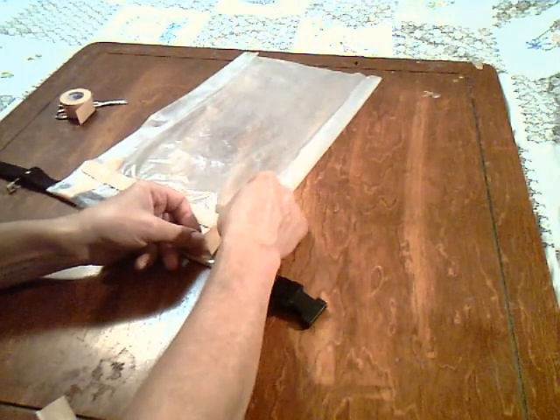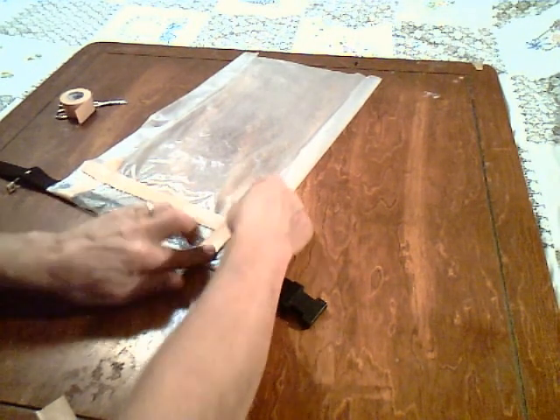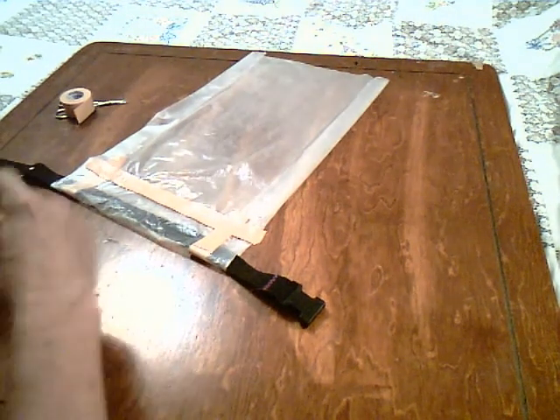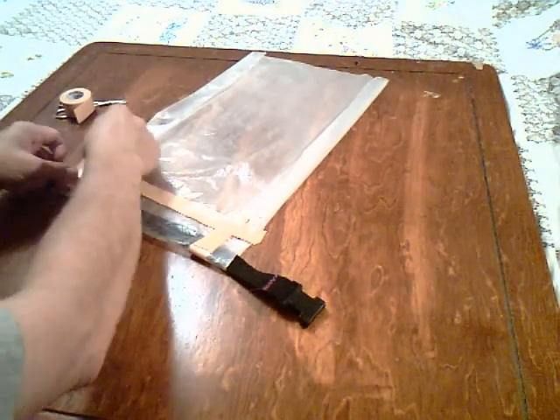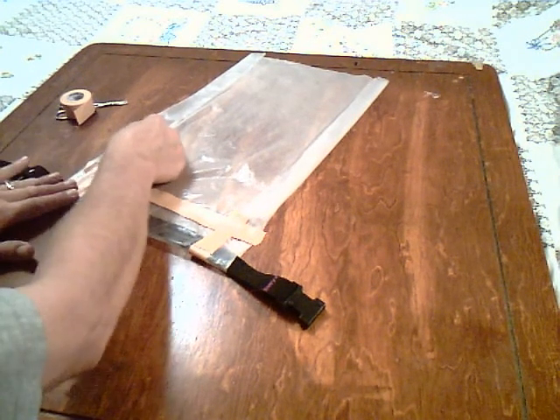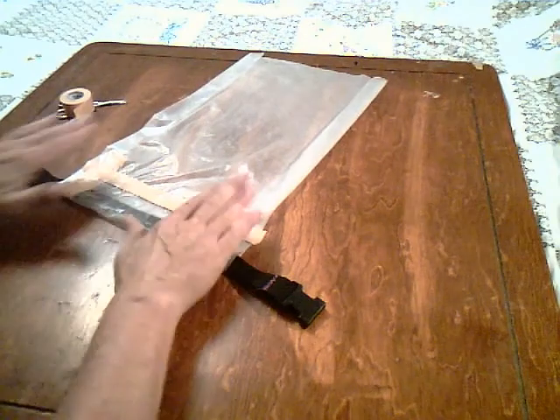Put another couple pieces of tape down the side, and that's basically it.